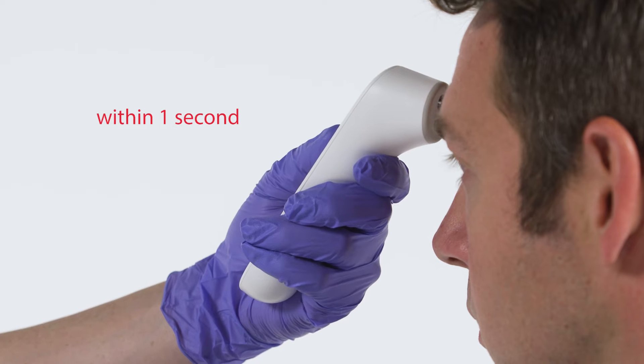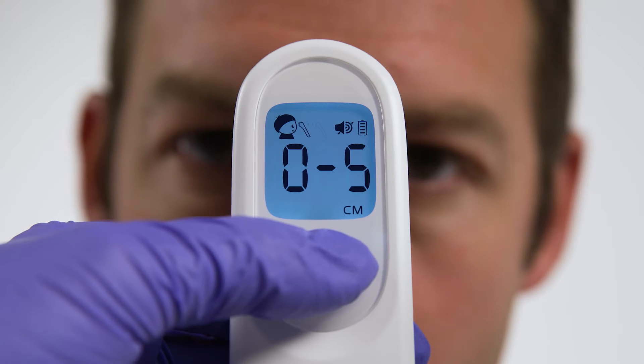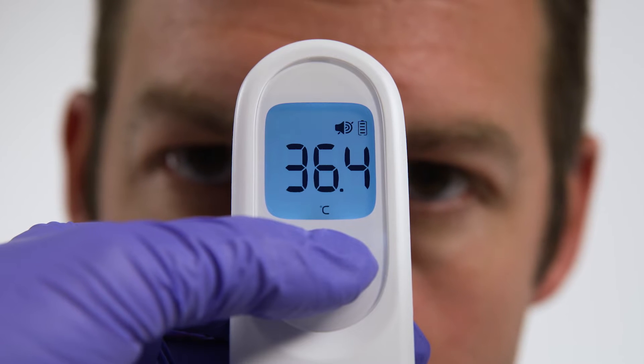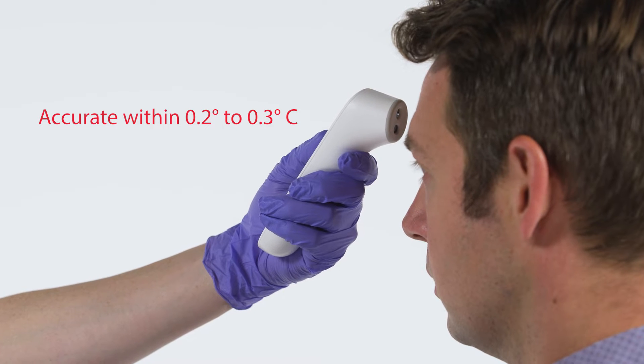Fast because the NCIT returns temperature readings within one second. Accurate because the NCIT has been tested to meet ISO standards and ensure readings are within 0.2 to 0.3 degrees Celsius.